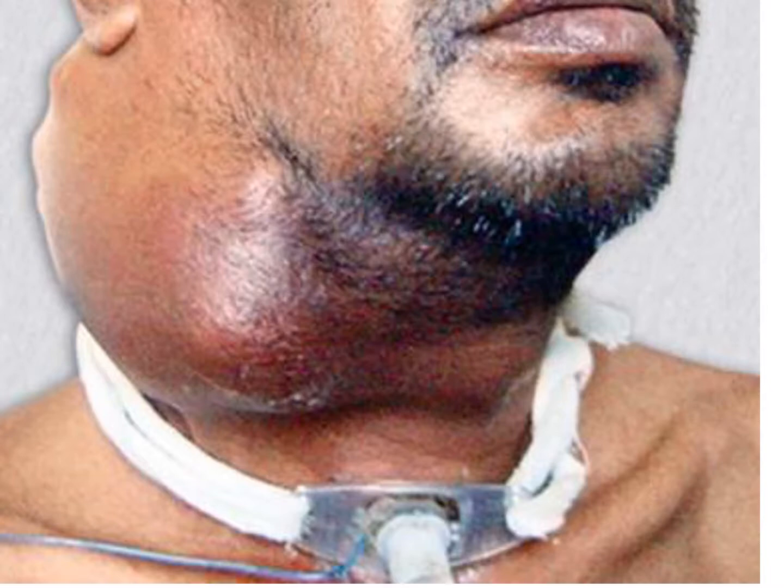Transverse incision can be used in elective tracheostomy. It is placed 2 finger breadths above the sternal notch with a length of about 5 cm transversely. It has got a better cosmetic scar.